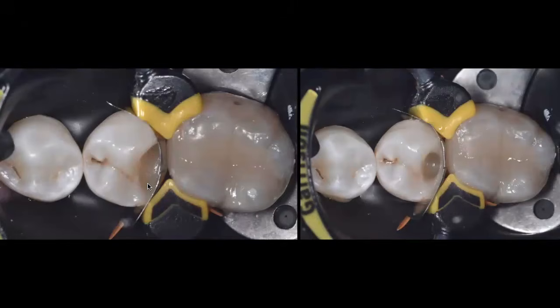thick from buccal to lingual, touching all that gingival floor, so that I know I have ideal adaptation of this first critical layer. Now, when I do this, I'm pushing that with a condenser, and then I use a micro brush and I wet it on my adhesive only, and then I start pushing that layer again. I take my time, I take maybe 30-40 seconds. I'm just playing with this to make sure that I'm pushing it enough to get intimate contact in between that layer and the gingival floor.